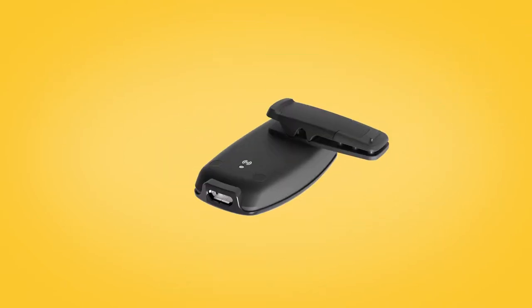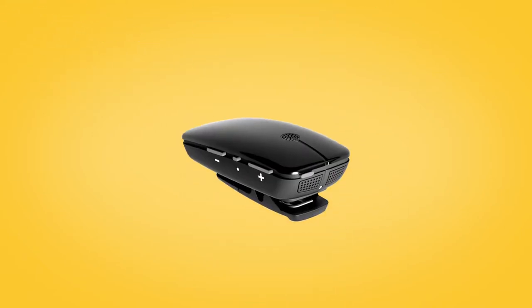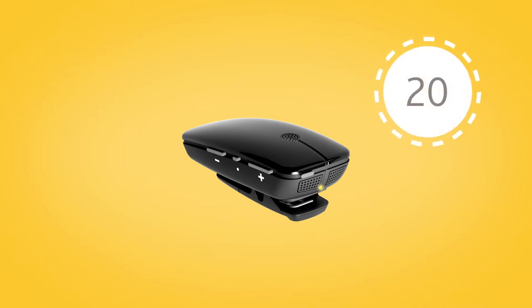To begin pairing, press the pairing button on the back of the mini microphone using the tip of a pen or similar object. The LED on top of the mini microphone will blink yellow every two seconds for 20 seconds to indicate it is in pairing mode.